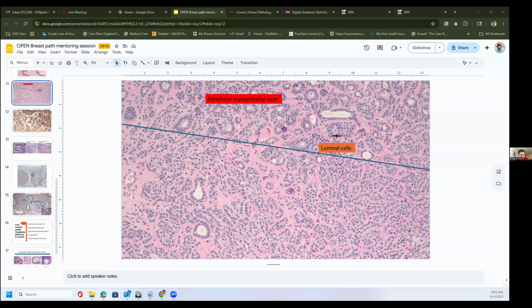Yeah. So do you see my screen? Yep. So this is the slide that I showed. I think I went a little fast. The point was when you're looking at a slide at this stage, maybe in 1 year, you will be noticing things, and you may not be noticing very minute things.